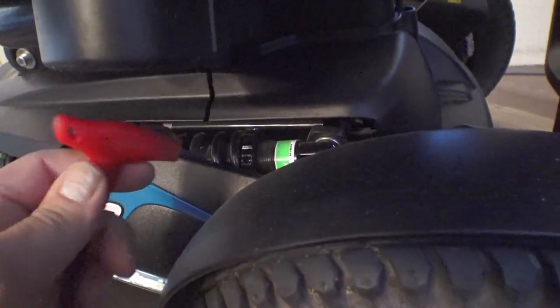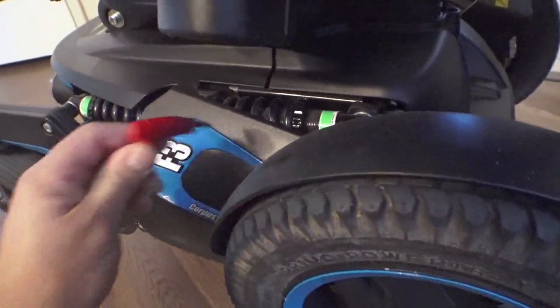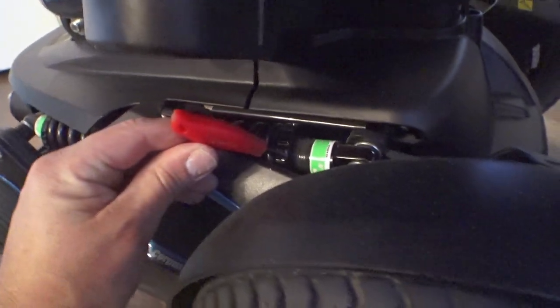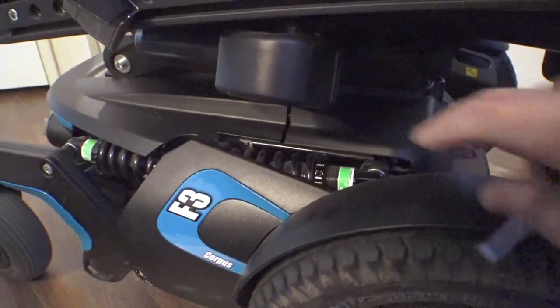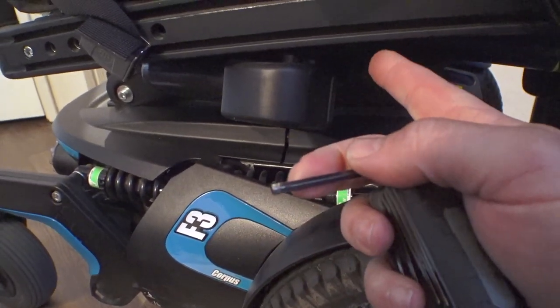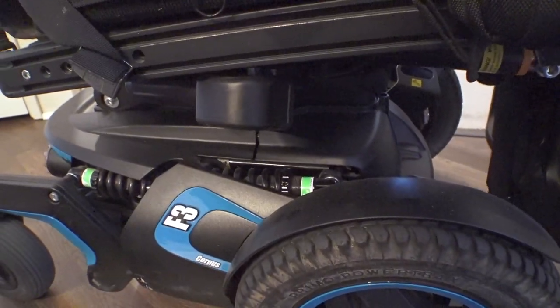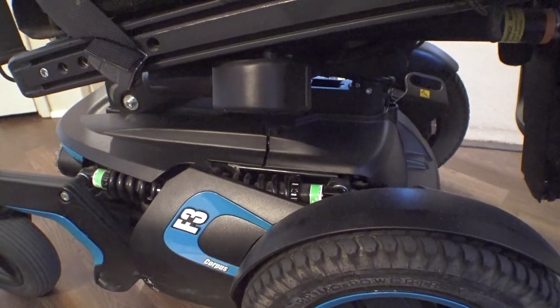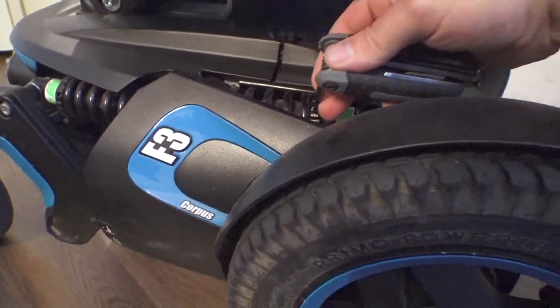We've got the power leg actuator and the fender here. All you have to do is stick this thing in there and turn it a little bit at a time. Now if your chair has a seat elevator, it's probably going to help to lift it up. If you don't have a seat elevator, all you need is power tilt — that gets you enough clearance to be able to get in here with your folding allen keys or your right-angle ones.